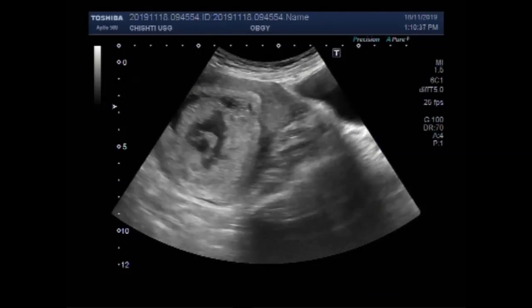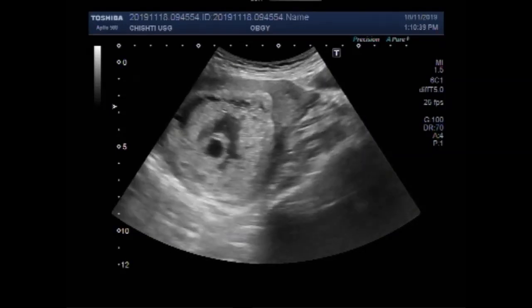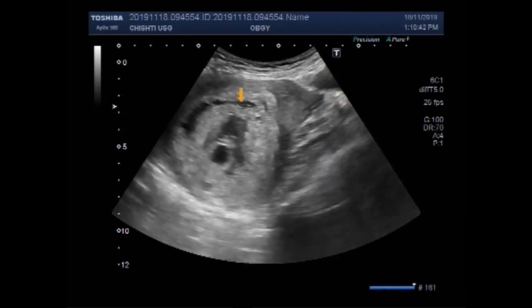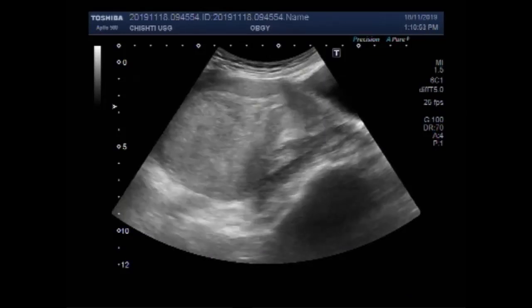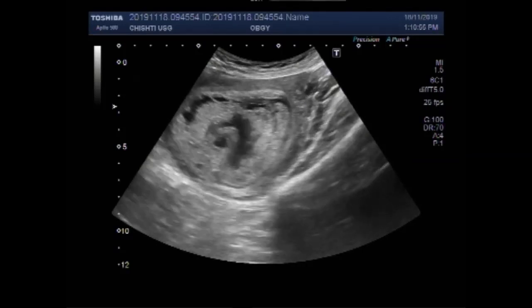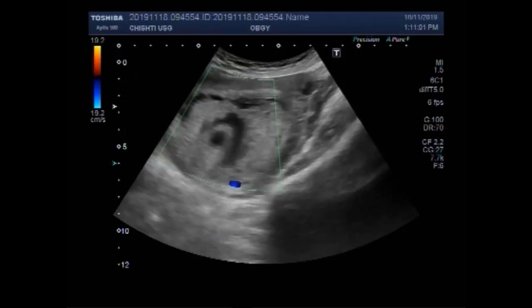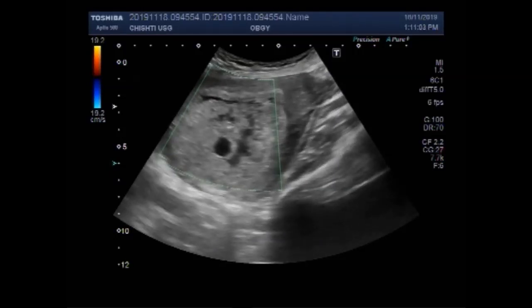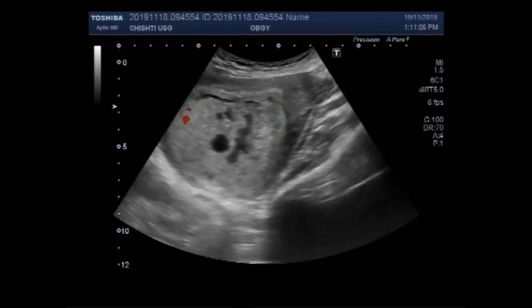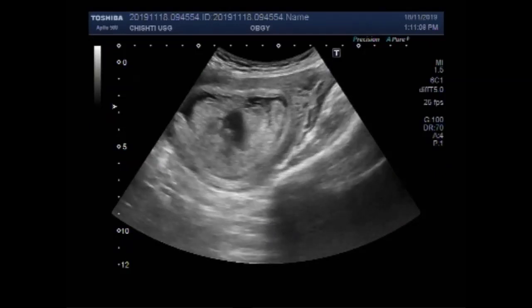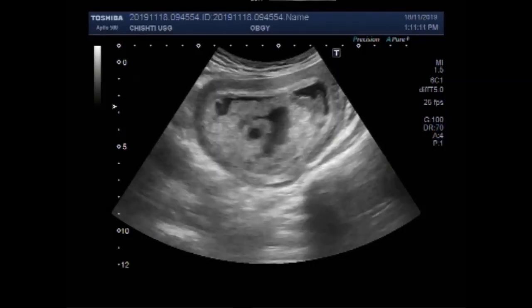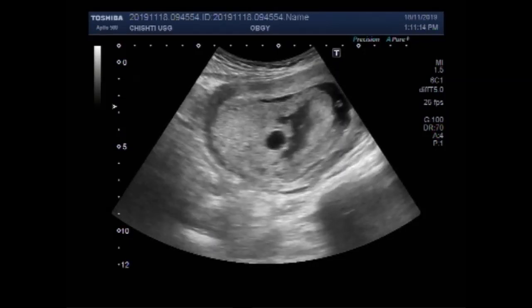Now you can see the gestational sac in the distal portion of the uterine cavity, and there is no fetal pole visible in its interior. These are the products of conception, and a fair amount of debris, clotted blood, and products of conception are seen in the gestational sac.